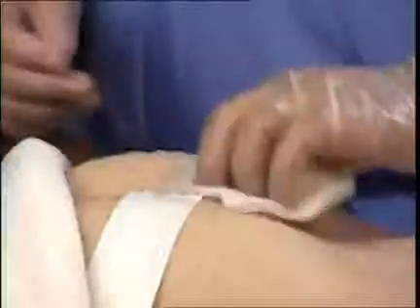Once the injectate is done and the image is recorded as necessary for the medical record, the probe is removed, the needles are removed, the area is cleaned, and then a Band-Aid is placed over the wound. And thus, this concludes a successfully placed caudal epidural steroid injection.